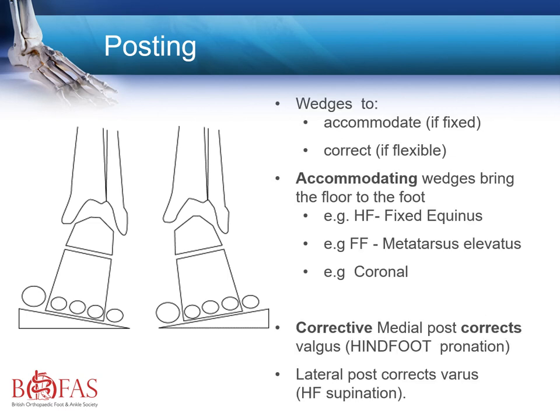Here we return to the key point from earlier, where a fixed deformity can be accommodated by a tilting of the sole using a post, whereas a corrective posting will be useful for a flexible deformity.